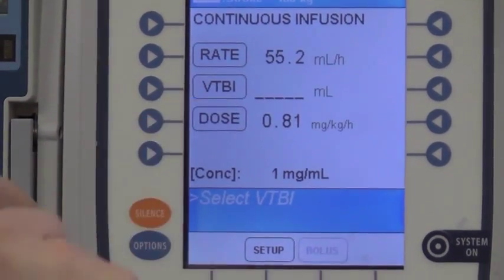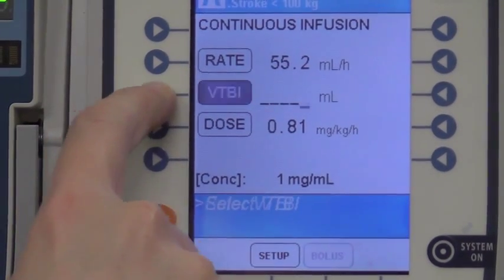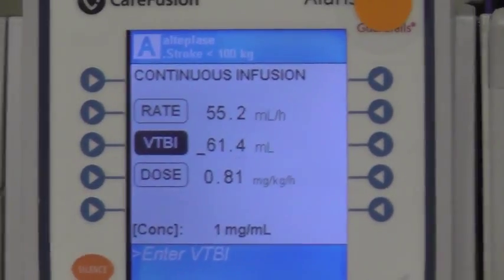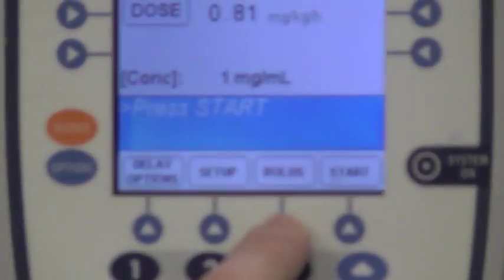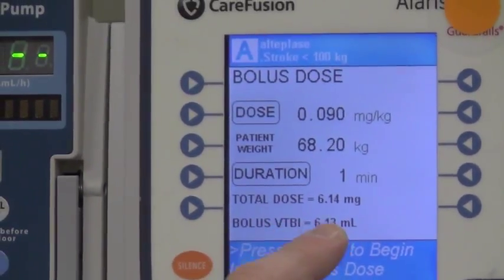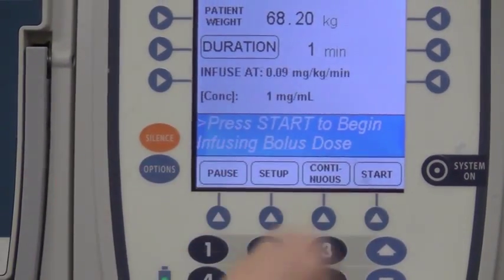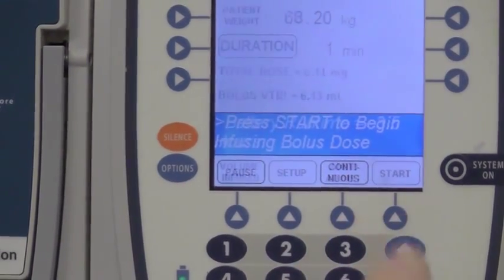Once we have those three fields filled out, we basically have everything set up. We'll hit next. There is the volume to be infused — this is the total amount of liquid in this bag, so it's 61.4 mls. Down here on the bottom screen you see the bolus feature. Because we want to give the bolus over a minute, we hit bolus, and the pump will calculate the 6.1 milligrams of bolus to be given. Now all we have to do is hit start.